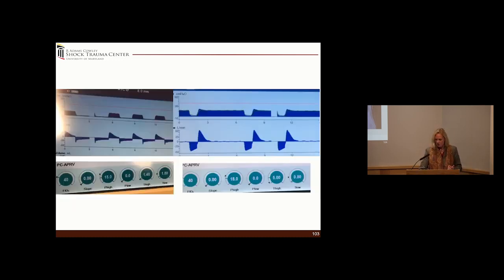So again, look at the peak expiratory flow rate. It's not even 20 liters, and it's very flat. And then here it almost doubled, it went up to 40, and then the T low had to change. So very different. And again, you can assess that, which I don't have, unfortunately, is that when it went to 40 liters and all the way to 0, the angle was much steeper.